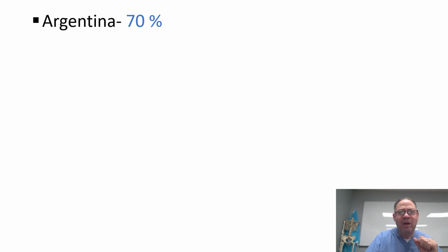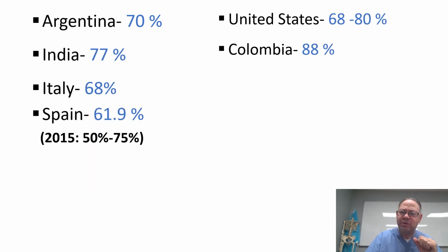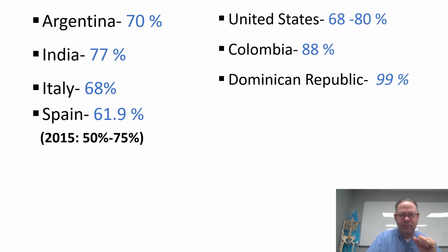Okay, now, when we talk about pre-analytical errors, cuando hablamos de los errores pre-analíticos, mira cómo están los errores a nivel del mundo casi. Look how they are. All of that are pre-analytical errors all over the world.